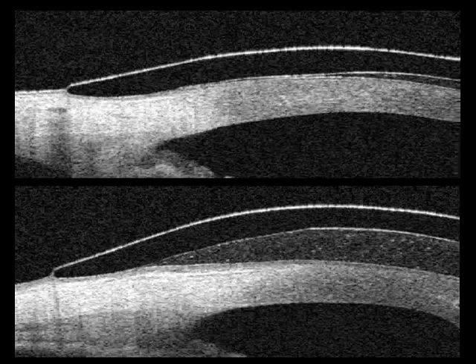And you can see that here. We've got our standard trial lens on eye. It's got a very thin fluid layer, almost nothing. Probably through the slit lamp it would appear to be bearing. If we order from the lab a limbal clearance zone +5, that increases this angle, giving you far more vault through the limbus here. So limbal clearance zone increases that area under the limbal area of the lens.